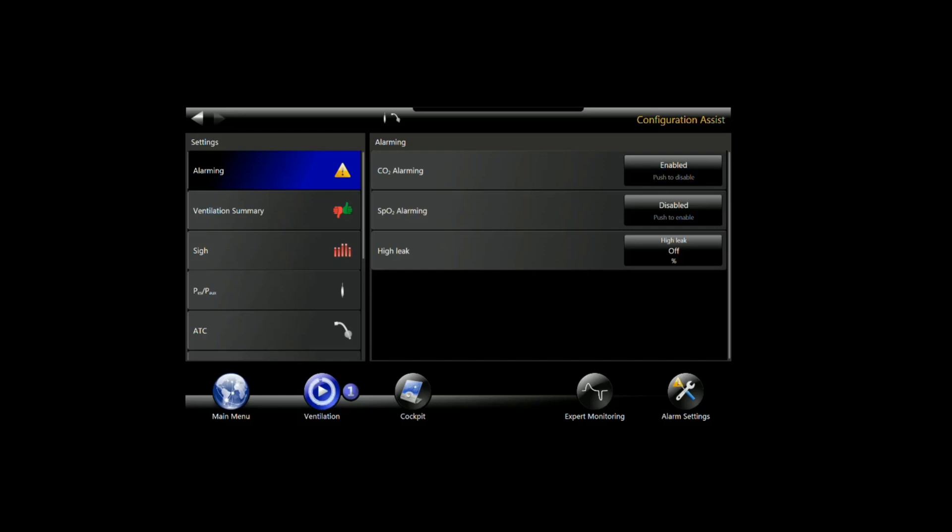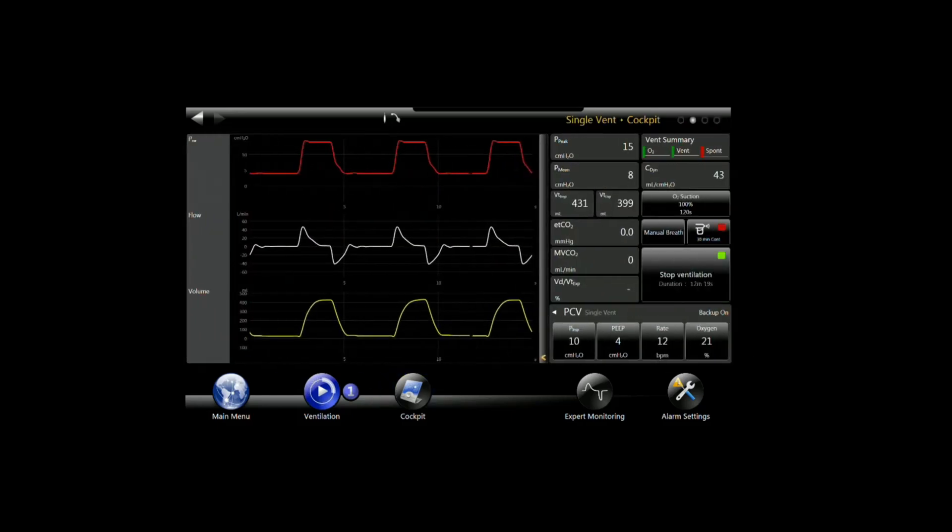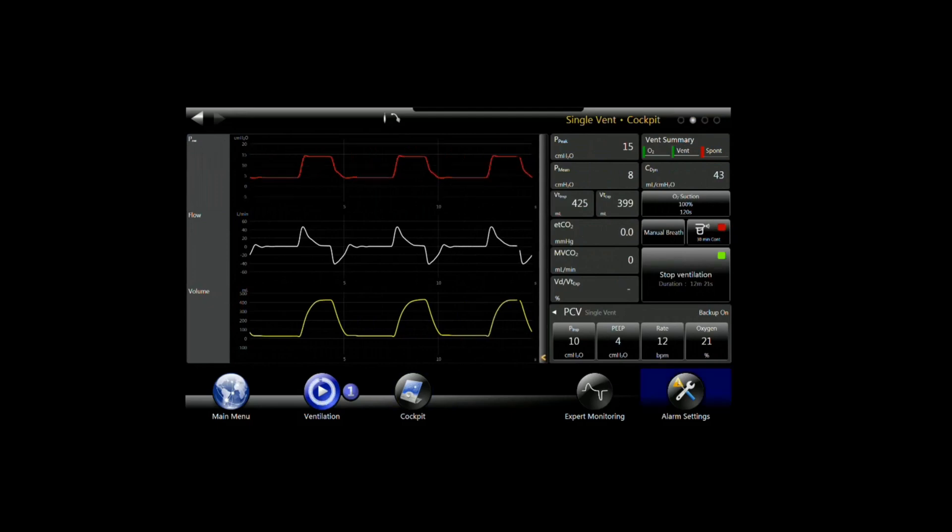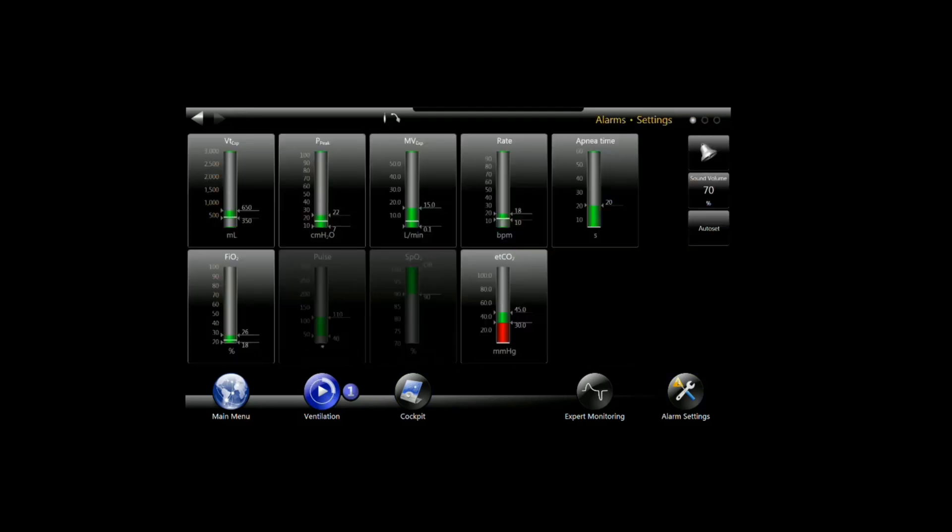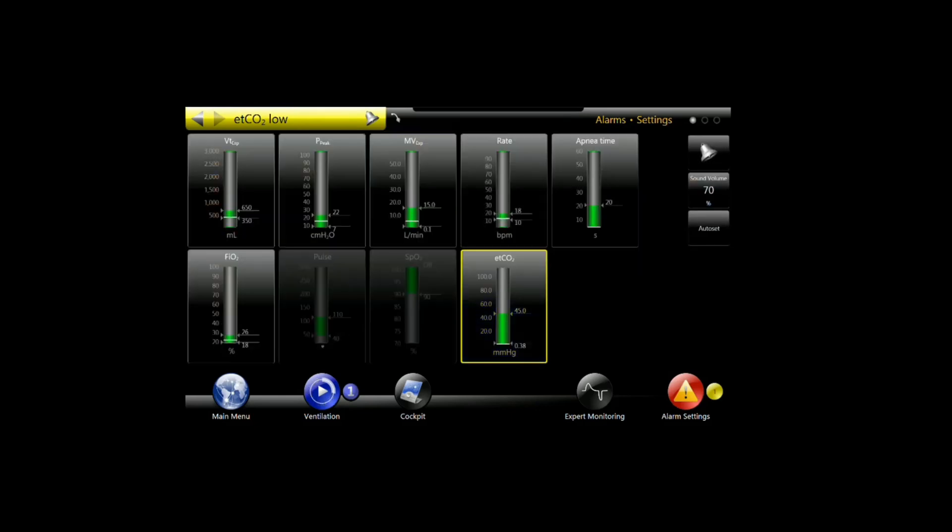Now that they're enabled, we'll jump back out to the cockpit screen. If we go to the alarm settings page, you'll see that now we have an end tidal CO2 alarm available. I'm going to go ahead and drop that down so that we don't get any nuisance alarms while it's not in line.